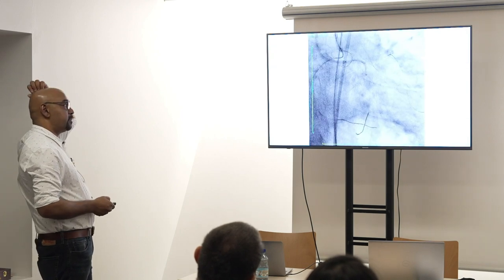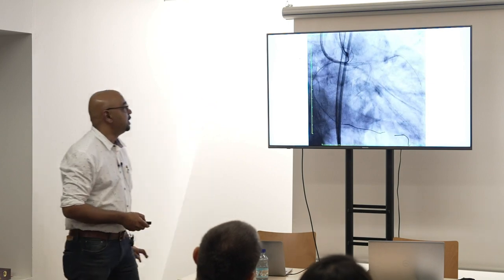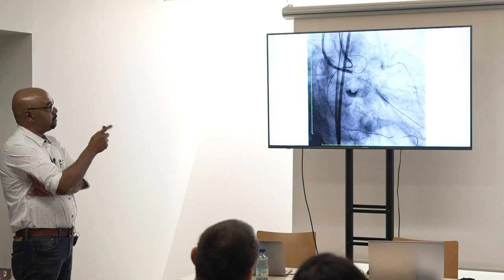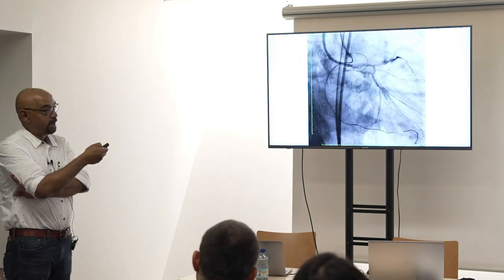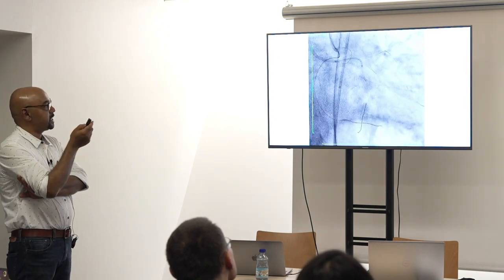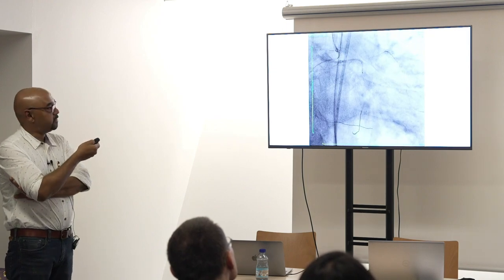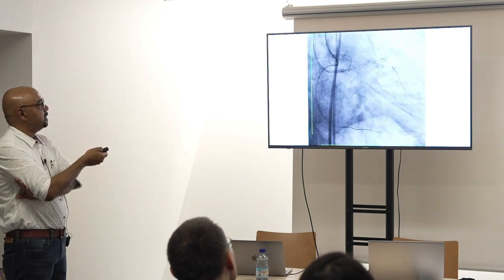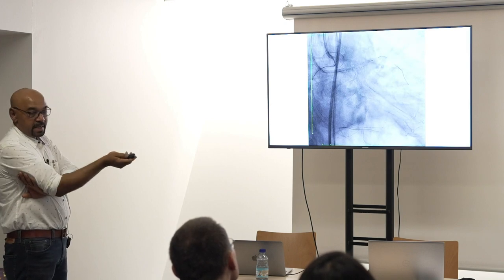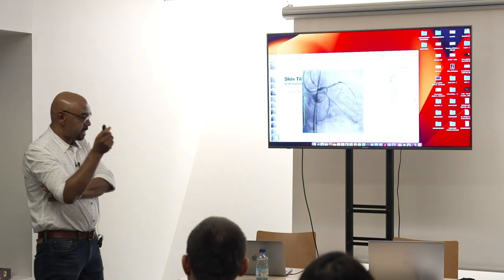So we ended up with quite a bad extravasated lesion. Probably it was outside the vessel, but it didn't bleed. So by this time, I realized it was enough with that OM. So I stented into the circumflex body using a Guidezilla because it was too bad. We could not negotiate anything through that. And this was the final result. Patient is discharged. Then I went back and finished the RCA. So thank you. This is my presentation.